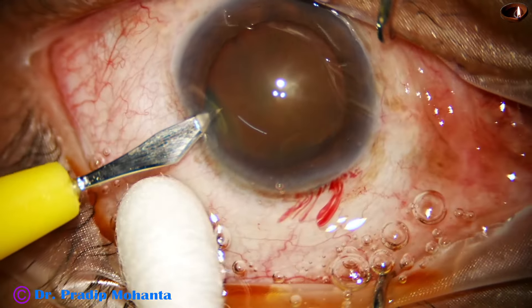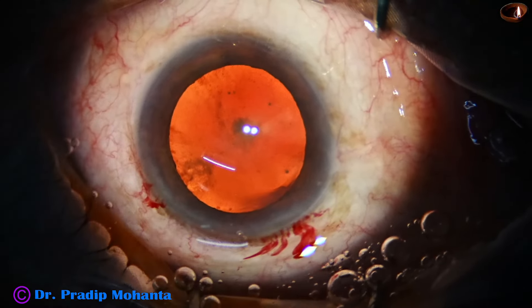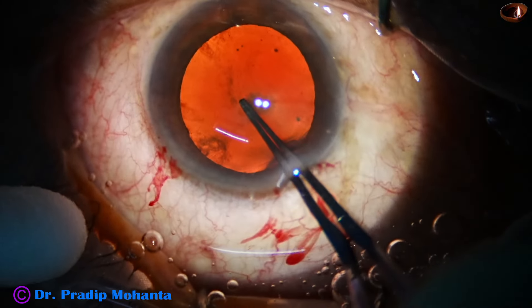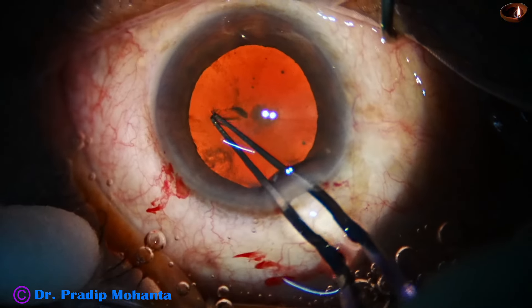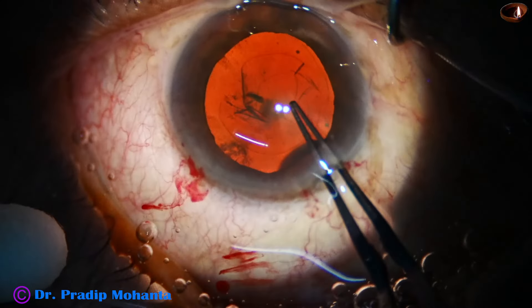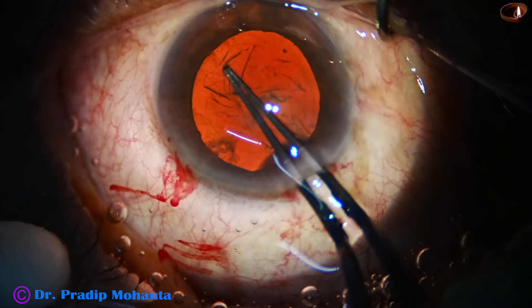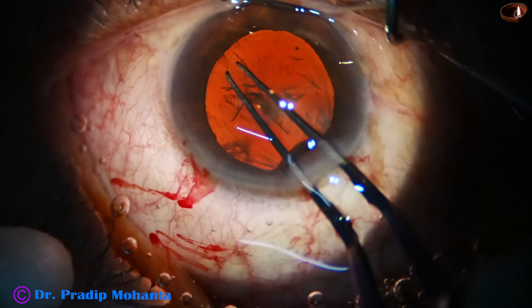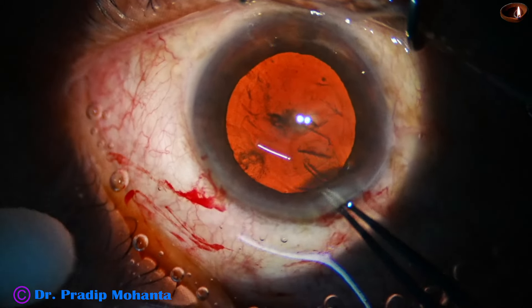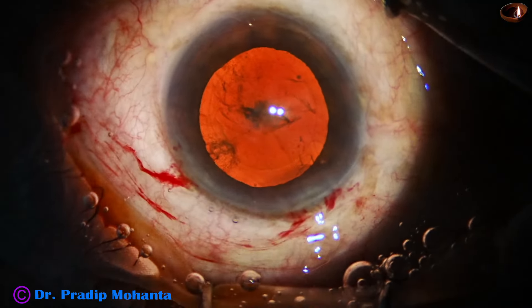Some brown hard cataracts give a very good red glow particularly in grade four nuclear sclerosis, so I'm not going to stain the capsule — see the beautiful red glow. The side port has been made about three clock hours away from the main wound on the left side. Utrata forceps is being used to do the rhexis, and as I go to about seven o'clock I find the rhexis is going to be small, so I deliberately make it larger by going a bit more to the periphery, making the rhexis a bit eccentric.